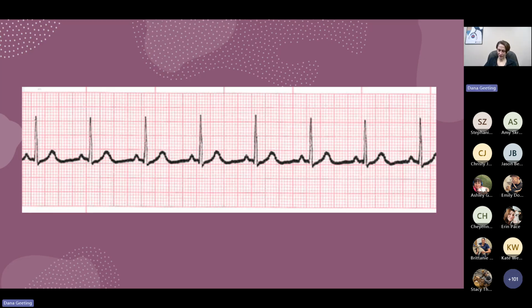All right. Here, again, first thing you're going to want to always look at and assess is, do you have a P wave for every QRS wave? For R on T, you're just going to have usually one random beat, whereas V fib, R on T can lead into it or torsades.